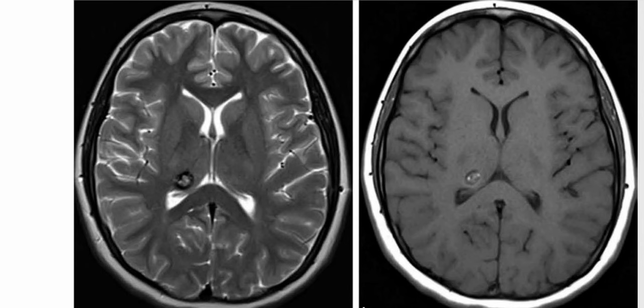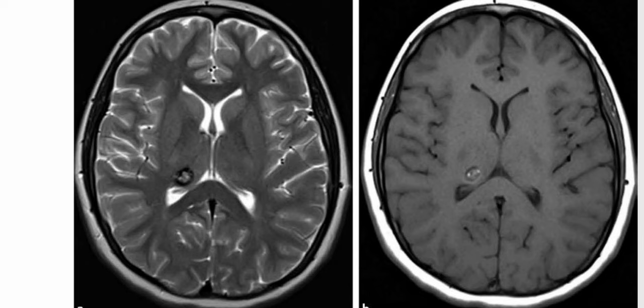Next, we have a 16-year-old boy presenting with chronic headaches, and these are the images provided. Also, you can see that this is the post-contrast sequence. So now we can see that on the axial T2 weighted MRI, there is a circumscribed right posterior thalamic lesion with increased signal centrally and a rim of prominent decreased signal intensity.